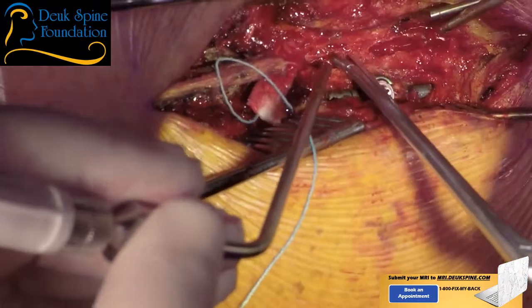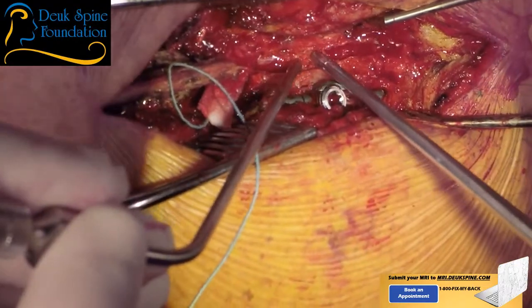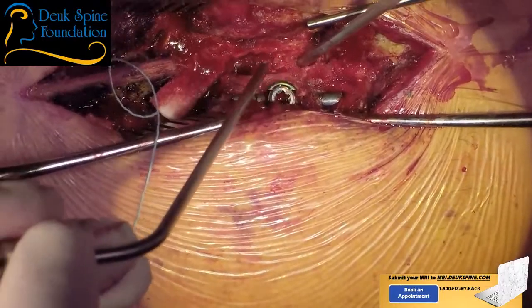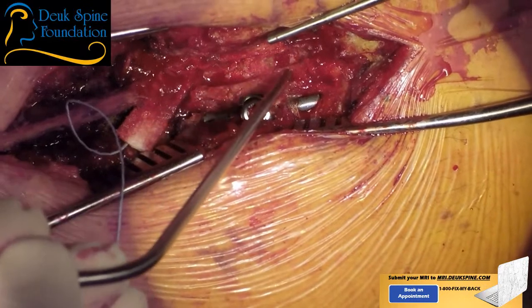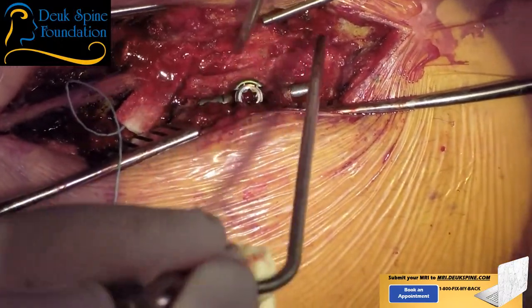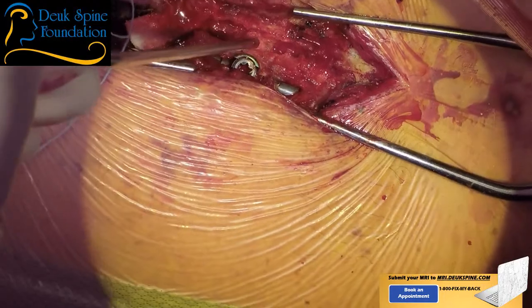Sweet Jesus, look at that. This is what's crushing the spinal cord from the back. And what I really want is to get in here. Stop. Come out. Right here. Because if I can get in there, let me have the narrow bite. Yes. Then I can come up from the bottom up, which is always better in a laminectomy. Come from the bottom up. Take.